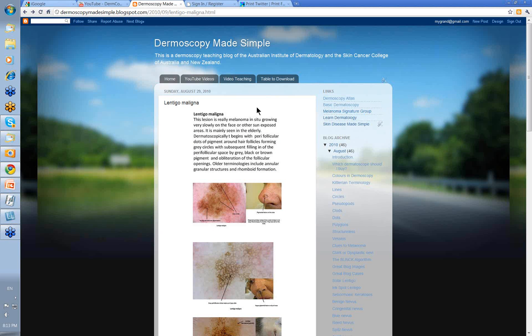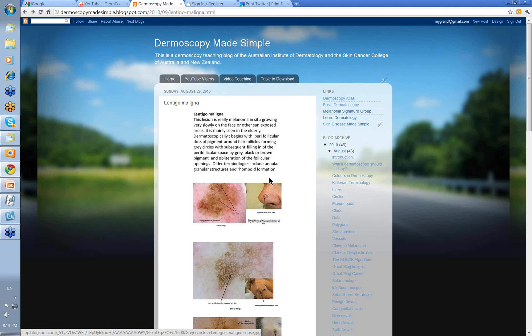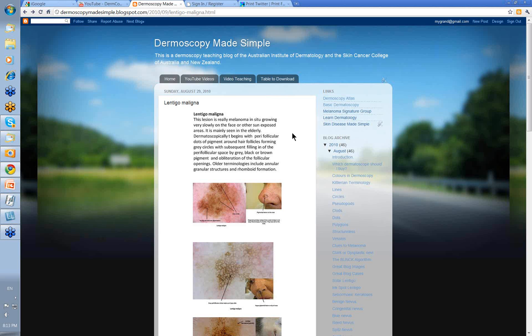Lentigo malignas can be seen quite commonly. They'll present on the face or other sun-exposed areas, mainly in the elderly. You'll probably see they've got a variety of pigmented lesions. The ones that are uniform color are usually solar lentigos, while ones that have variability in color within the lesion are possible lentigo malignas. You've got to put your dermatoscope on them to see if you can identify the features of lentigo maligna.